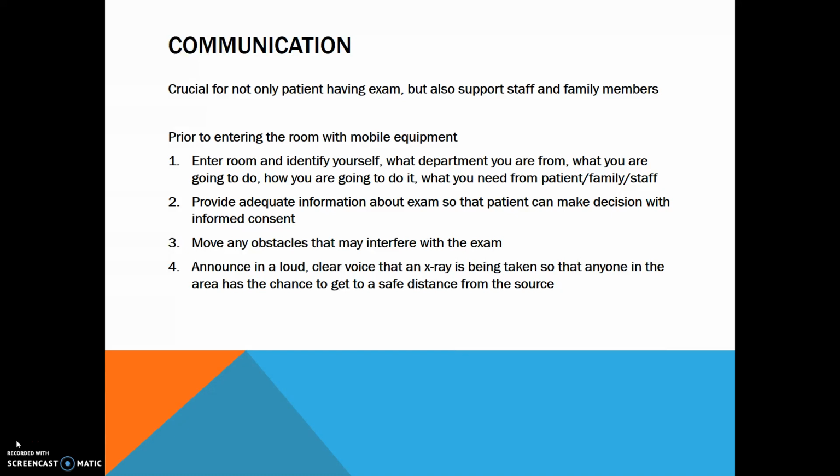Provide adequate information about the exam so that the patient can make a decision with informed consent. Move any obstacles that may interfere with the exam before bringing the machine into the room. And then after setting up the machine, announce in a loud, clear voice that an X-ray is being taken so that anyone in the area has the chance to get to a safe distance from the source.